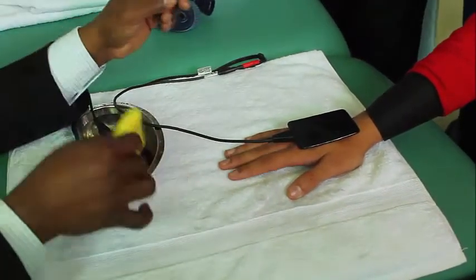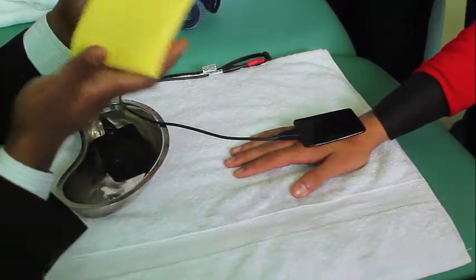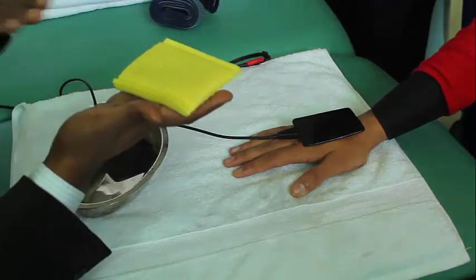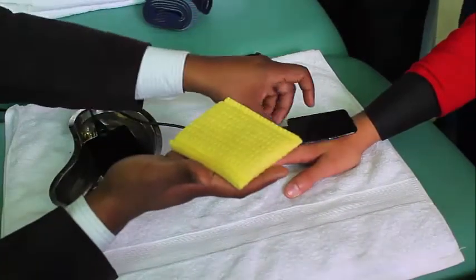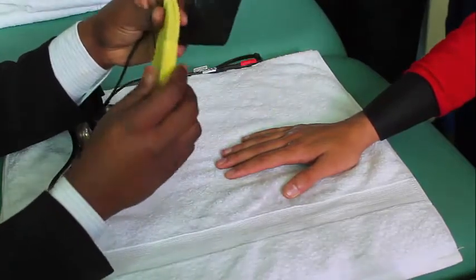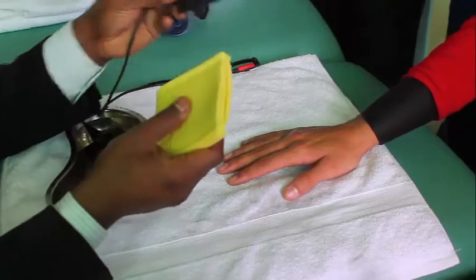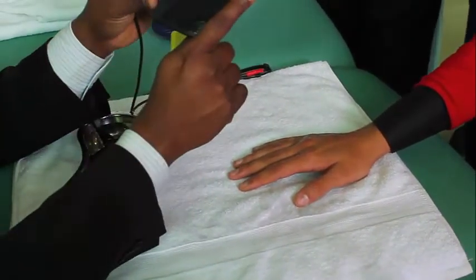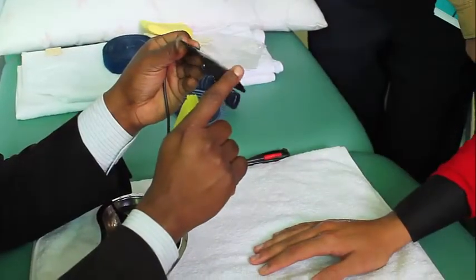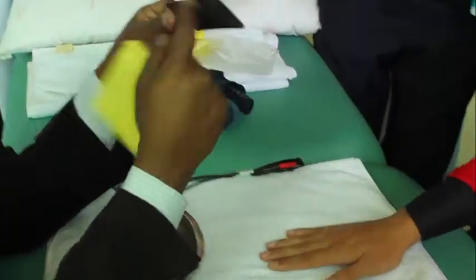So that is the reason I use an electrode cover, which is made up of sponge. So it will keep the water inside. It keeps the water continuously. And if you see the electrode, there are two surfaces for the electrode. Can you see here clearly? This is written, the name of the company's machine.